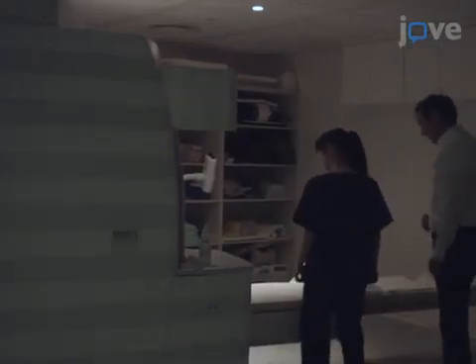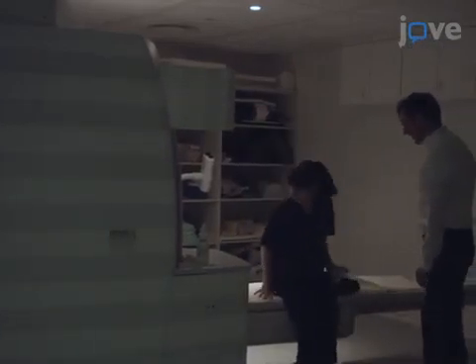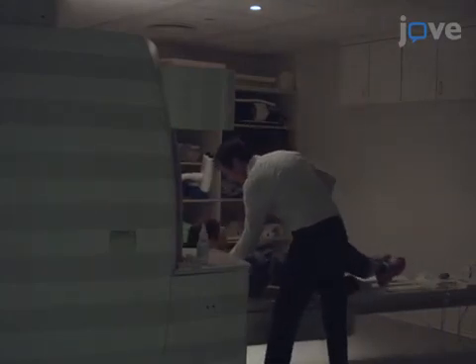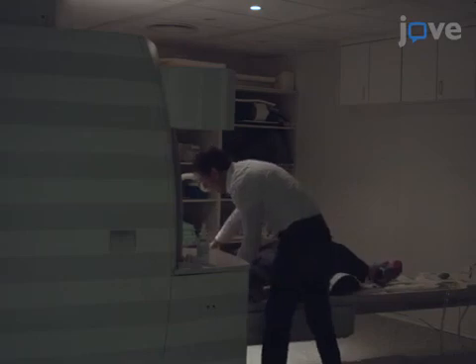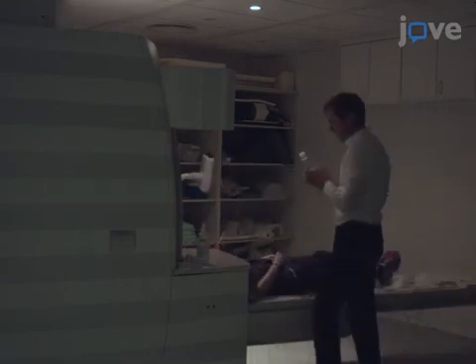Begin by escorting the patient into the MRI room and having them lie on the scanner table. Be sure to position their head straight at the isocenter of the scanner and then secure the head coil.